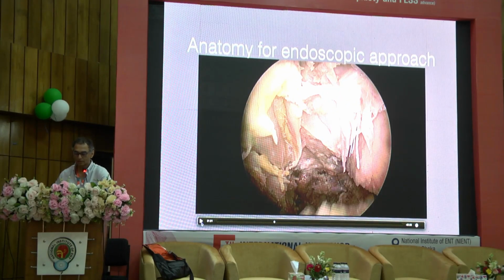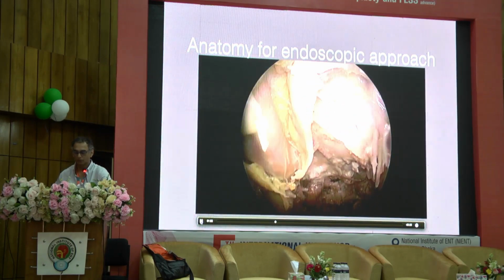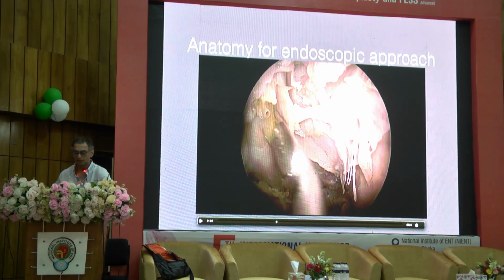Medial rectus, have removed the fat. Mucosa gone, bone gone, fat gone. Medial rectus, superior oblique muscle. And your artery comes out between these two. Okay? So now you see the anterior ethmoid artery comes always between medial rectus, superior oblique, and then continues in the skull base. If you're lost and you want to see it on the scan, look for medial and superior oblique muscles.